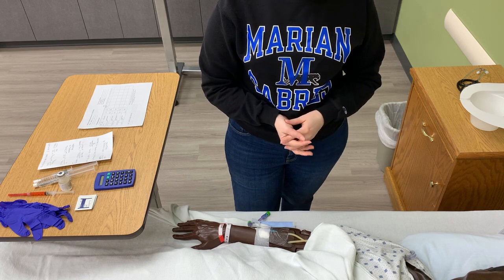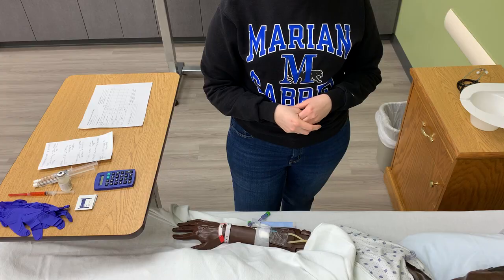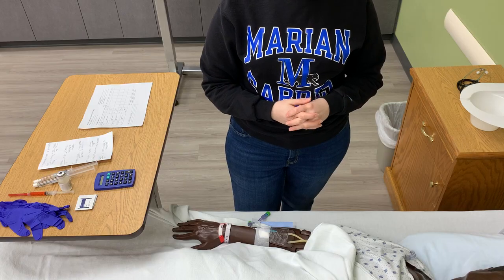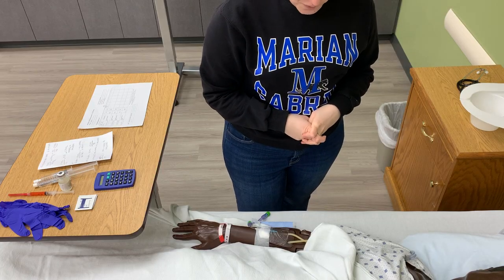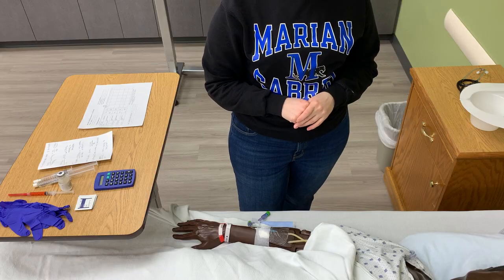So I'll explain that this is a diuretic. I know you're here with heart failure. This is gonna help get some of that extra fluid off of your body. You will pee a lot. That's how the fluid's gonna get eliminated, is through your urine. So we're going to be doing that. It's going to go through your IV. I'll be giving it over a couple of minutes. Do you have any questions before we get started?